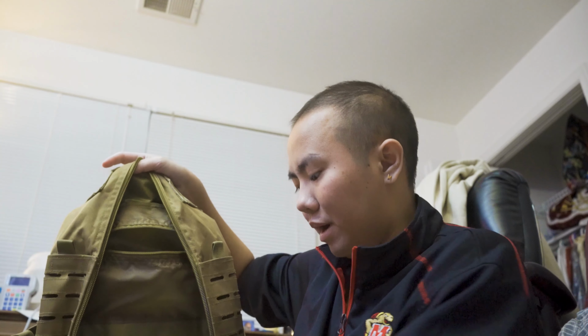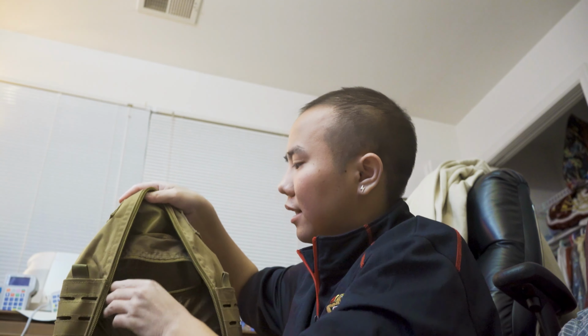The next thing is batteries, because there have been so many times where my pump would go off in the middle of something. My pump has this timing where it always goes off at the worst opportunity. What I'll do now is change the batteries out before I go into a movie theater, or if I'm about to talk, or something where being interrupted might not be ideal. I'm going to put them right in here because this is where the pump goes anyway, so it'll be best to just open one pouch and fix it real fast. Boom, boom, boom, done.